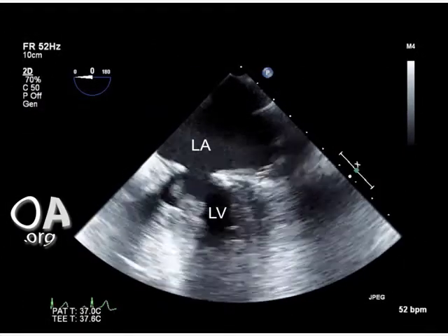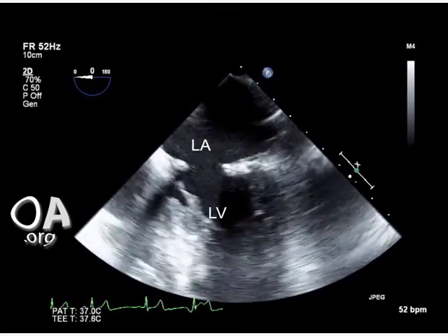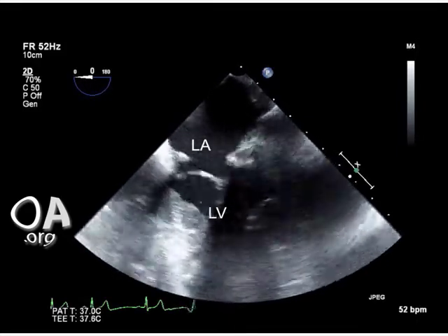This is a close-up view again of the mitral valve and septal relationship. It is important to note the contact of the anterior leaflet of the mitral valve in this case and bending or sweeping of the leaflet into the left ventricular outflow tract.